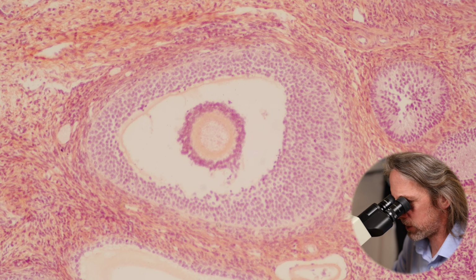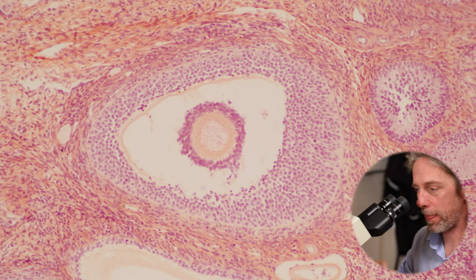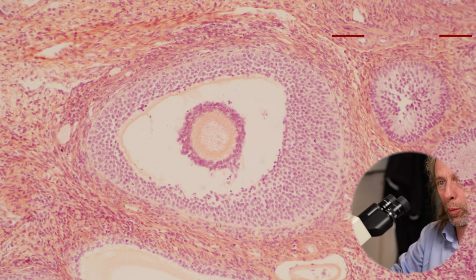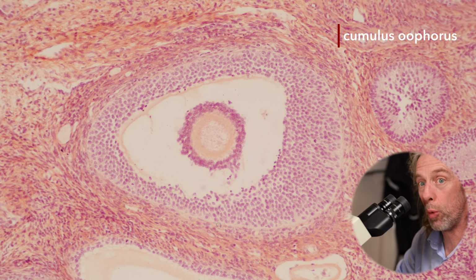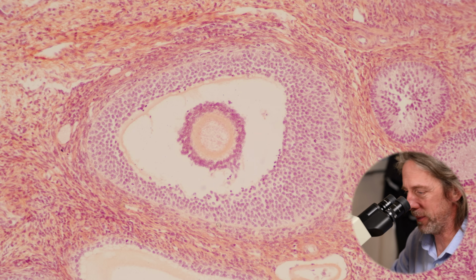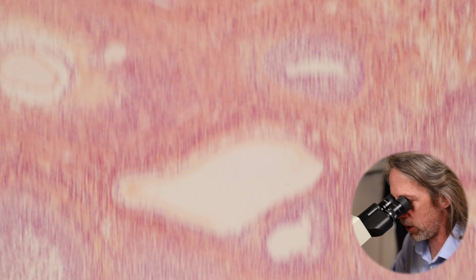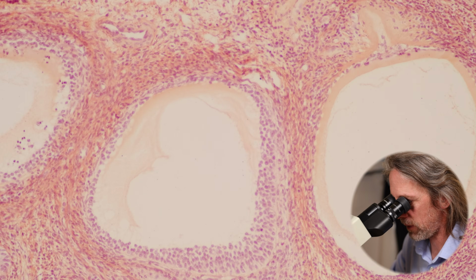Now what I'm looking for is, it's almost like I scripted this. Look, now the oocyte is there in the middle, surrounded by some supporting cells, and you've got the cells around the outside. It's actually still attached to the granulosa cells, but there's what we call a cumulus oophorus, which is Latin for a heap of egg supporting cells. Cumulus means a heap, a pile. But we just can't see it in that plane of section. Now we're starting to look at a Graafian follicle. Let's keep going, see if we can find the heap.